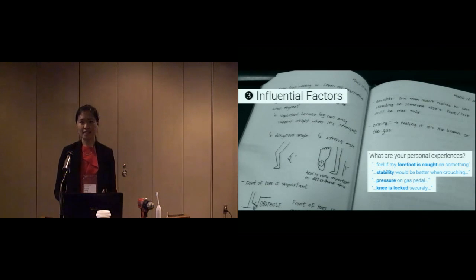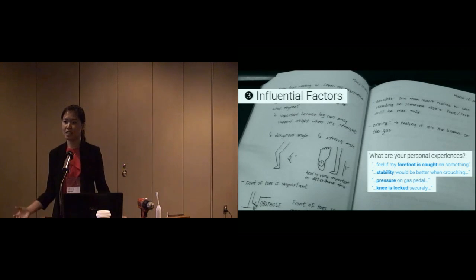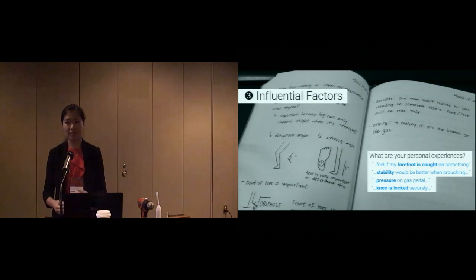But one thing we didn't anticipate was that one participant wanted to know the bend state of his leg. And this is because he actually had a low-end prosthetic that had a simple hinge mechanism at the knee. So if he were to accidentally shift his weight towards that side when his leg was even slightly bent, that would put him at risk of injury and falling.